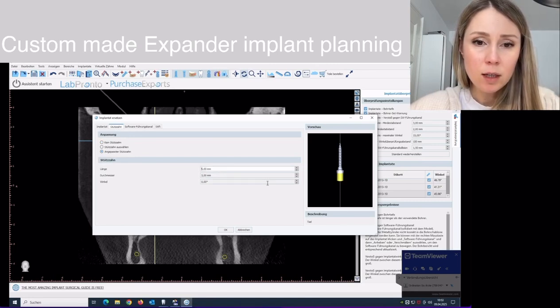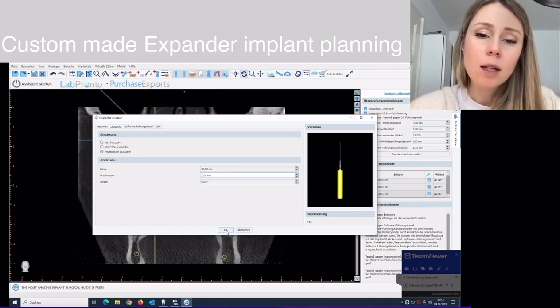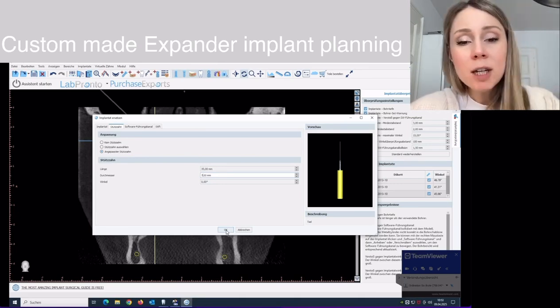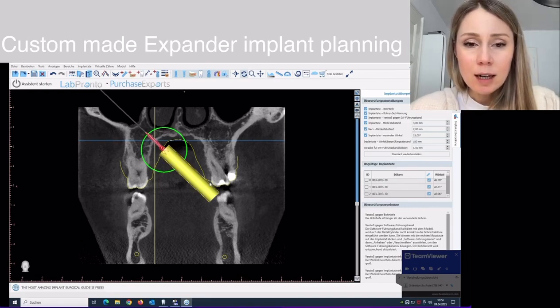So this must be 35mm in length and 7mm diameter. Those are the guides that come with Tadman or with ODL, and the information is courtesy of the Tadman lab, so I'm really thankful.